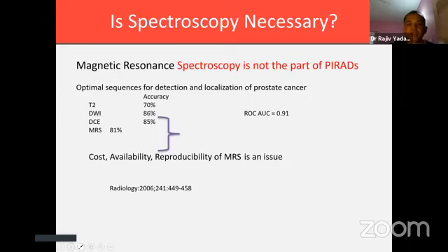What can be done is ask your radiologist what you will need. You need maybe a T1 axial, a T2 axial, a sagittal and coronal image, and maybe a diffusion. The rest of the information can be given to you on a CD. A CD costs maybe 7-10 rupees. But these films cost a lot of money. They are difficult to carry around, don't add anything, and we are wasting money. So tell your radiologists and centers we don't need this.